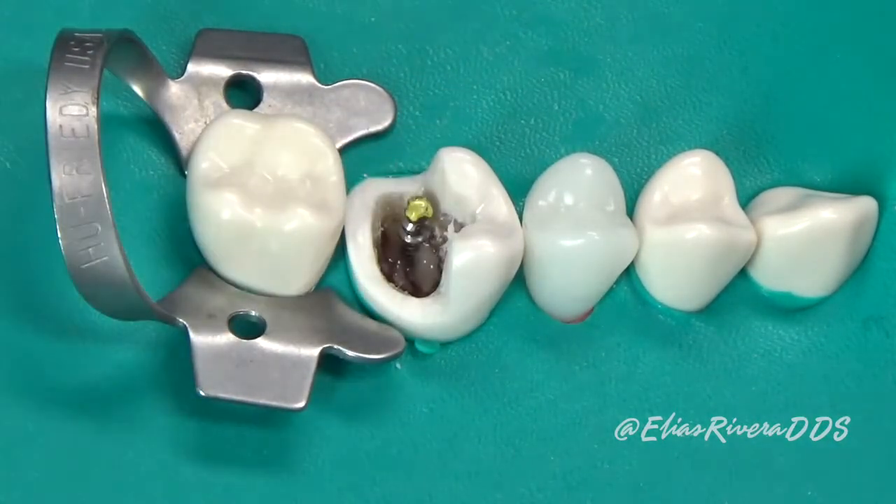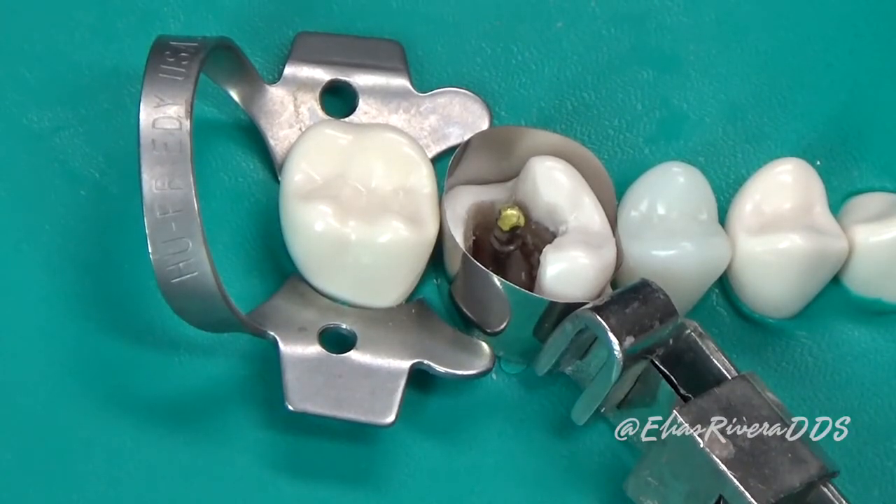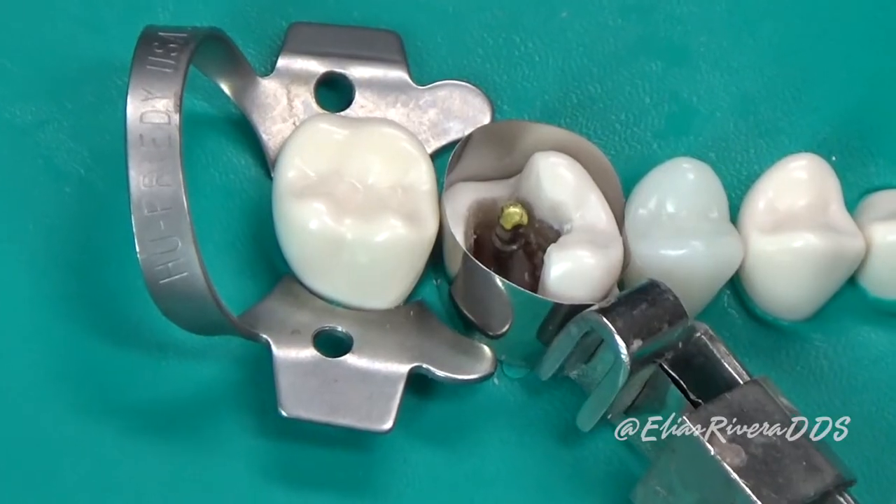Once the cement has set, we're going to place a matrix band and proceed to do our build-up using our material of choice.